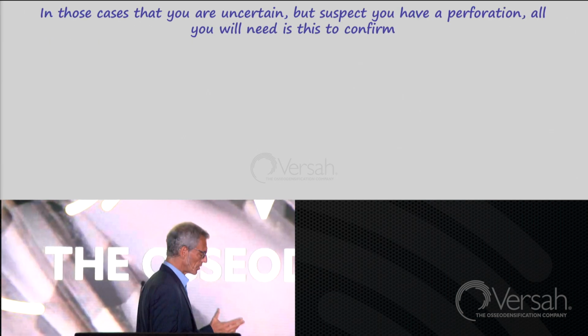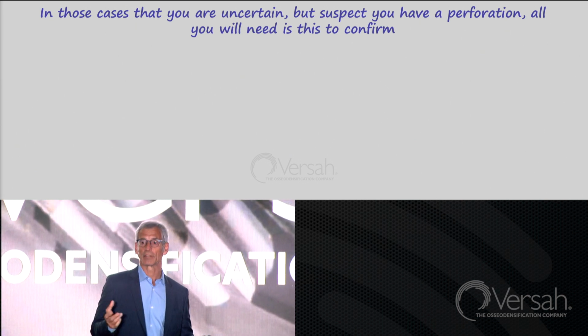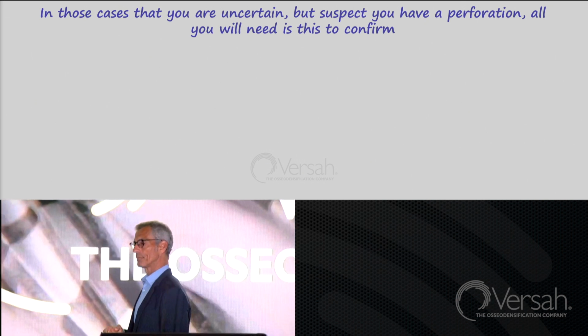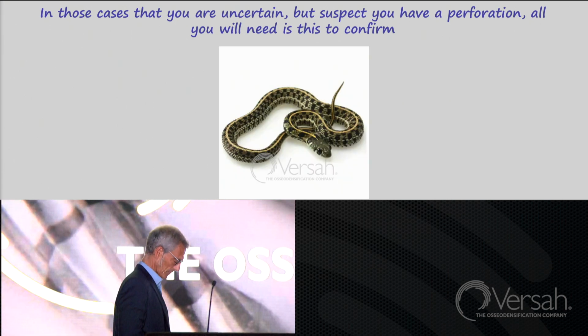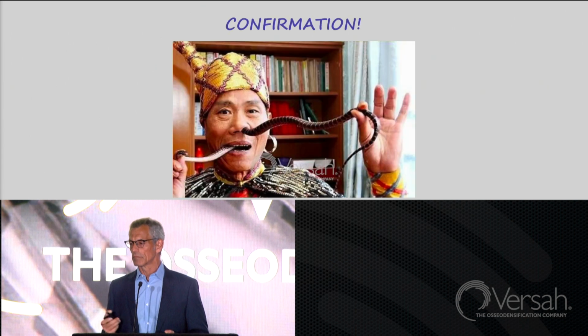Now, I mentioned to you that it is quite often that you will induce a perforation, but you won't be able to detect it. But if you're suspicious of a perforation, all you'll need is this. Confirmation.